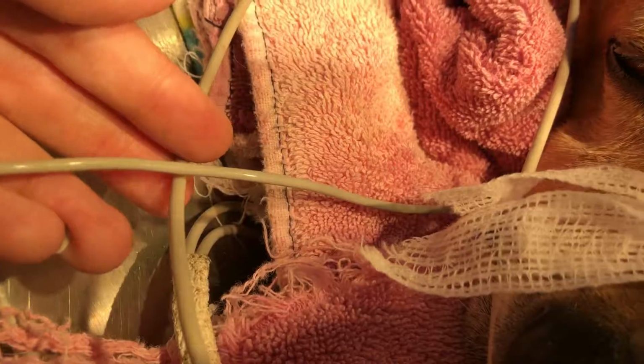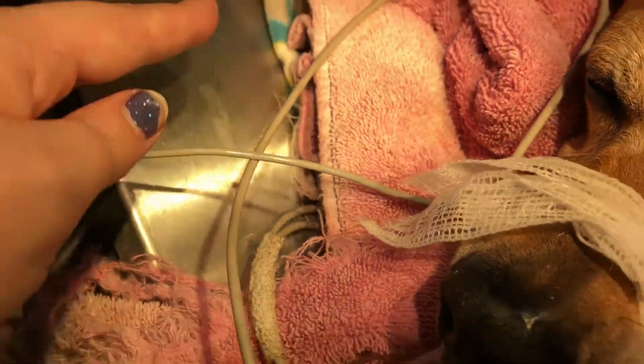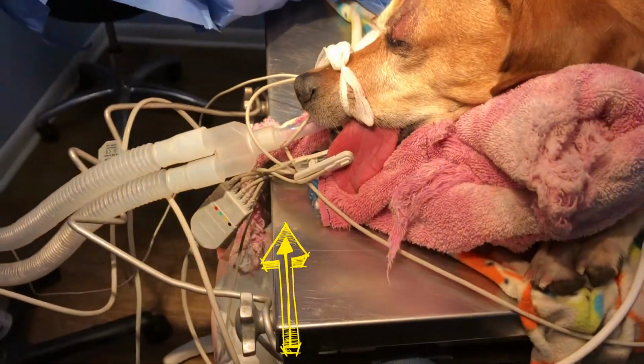And the way that you would use this machine, even though I don't have it, I can show you on my video, is that you would place it where the endotracheal tube connects to the breathing circuit. The capnograph sensor would go there, and then that way you would be able to monitor the CO2 going in and out.